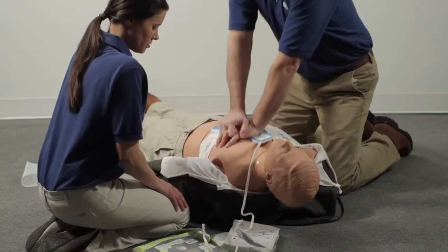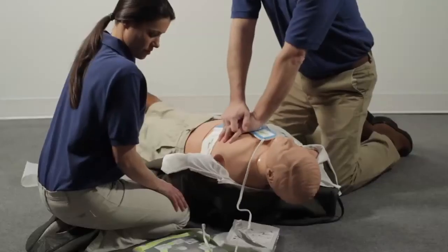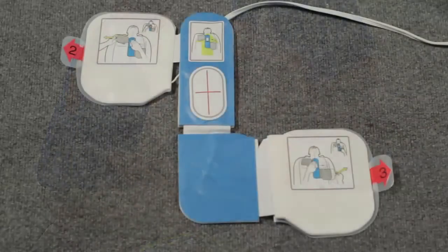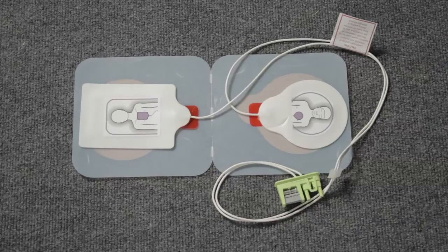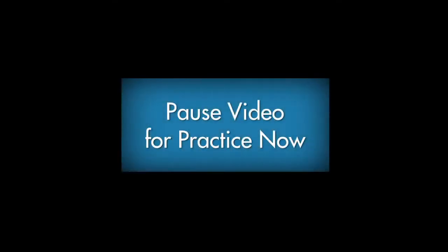Continue to follow the AED prompts. Do five full cycles of compressing the chest 30 times and breathing two times. If the AED tells you it is analyzing, do not touch the person. If a shock is needed, be sure no one is touching the person before pressing the shock button. Always use adult AED pads for adults. For children less than 8 years old or weighing less than 55 pounds, use pediatric pads. If pediatric pads are not available, use the adult pads. Never use pediatric pads on an adult.